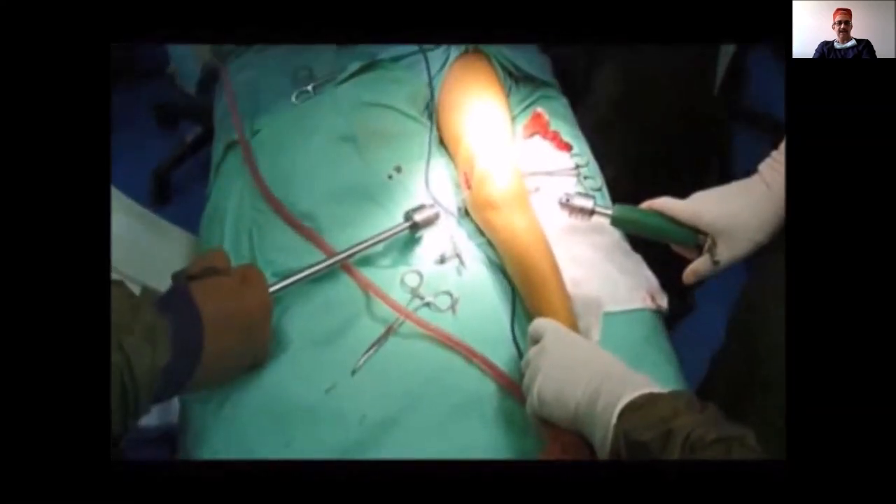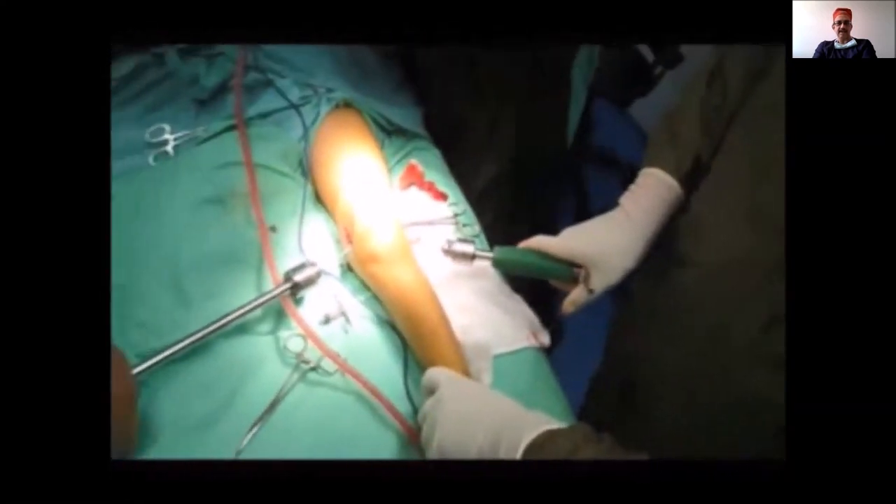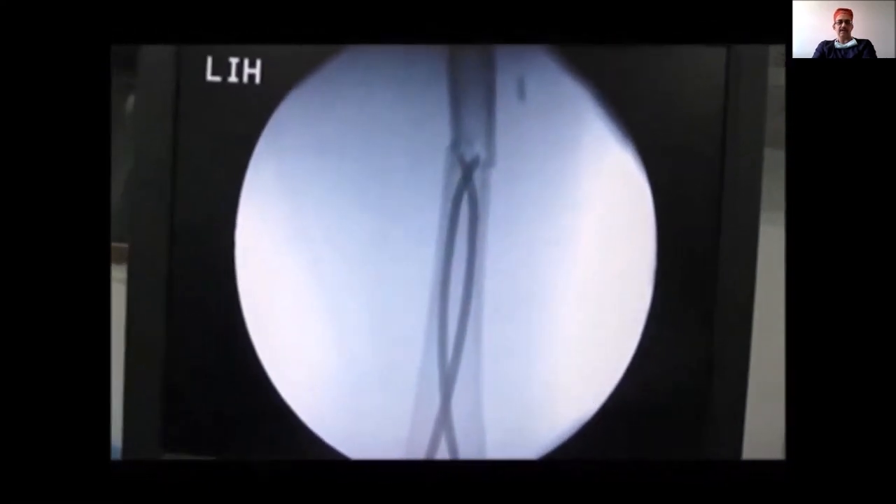Both nails are now gradually advanced to reach the fracture site. As seen in the video, with linear traction you have reduced the fracture. You now need to pass the nail into the proximal fragment.